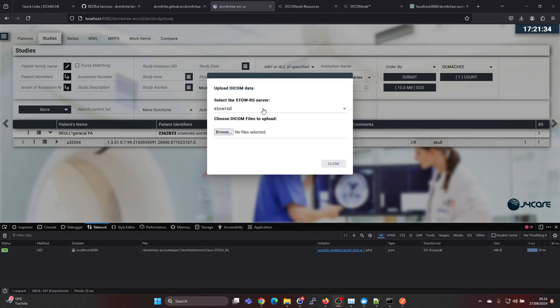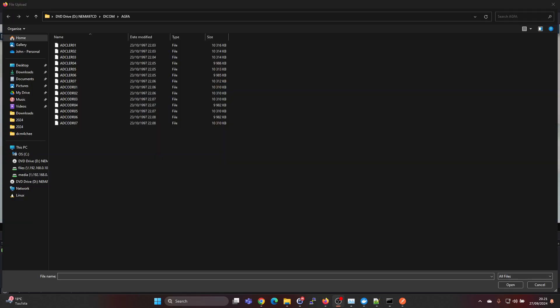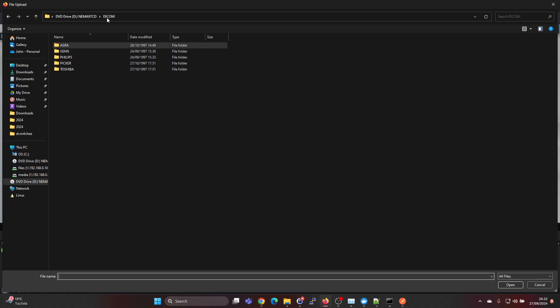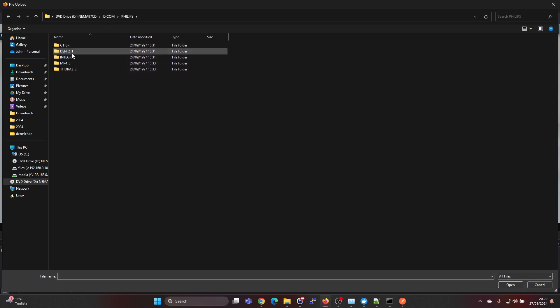Then select the server to Dicom4ChE, and then just browse for a study. We'll have NEMA. If you google for NEMA 97 CD you will be able to find this, so it has some studies here.